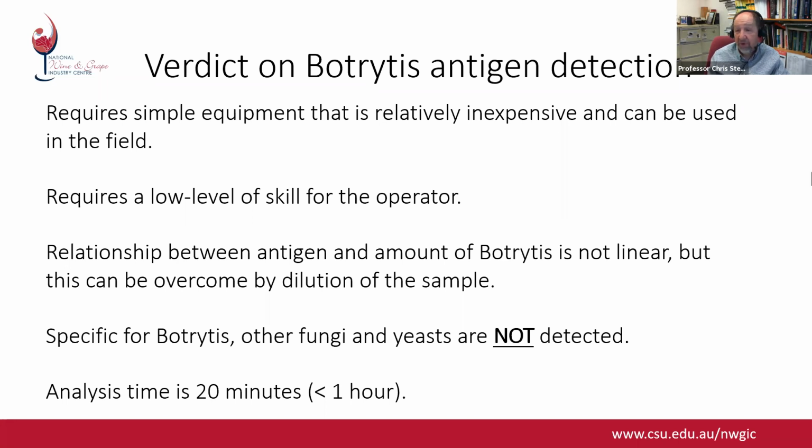So, 5 minutes perhaps to get your sample, homogenize it, spin it down, another 10 minutes to read it. So less than 20 minutes. So if you had to repeat the assay with a dilution, you might be looking at 45 minutes perhaps, less than an hour. But you could do multiple strips at the same time, as I showed in the earlier slide where I showed you the technique being used.